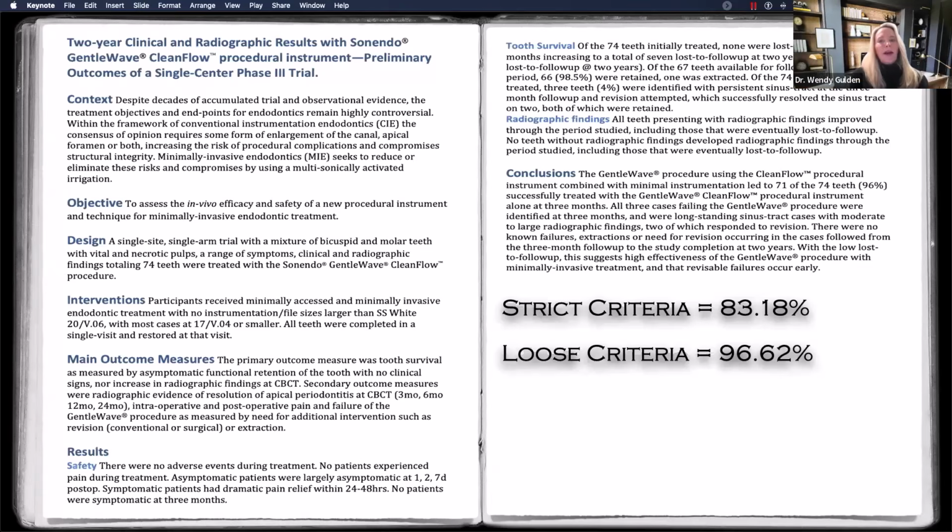So John, by full tone, do you mean 1 red bar? Yes. Depending on your apex locator, the bulk of them, you're getting closer and the beep gets faster and faster. Then you get tone and then you go past. So full tone. Beep, beep, beep, beep, beep. Then you're there all the way down.